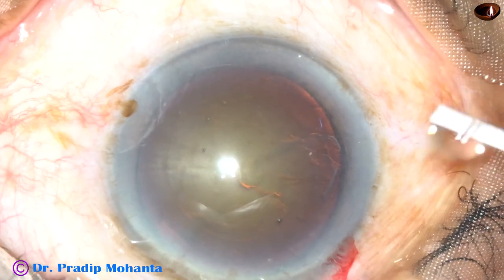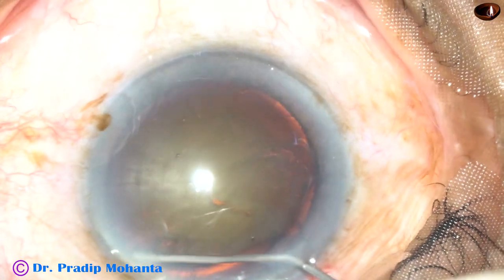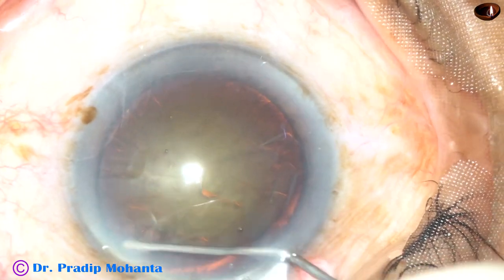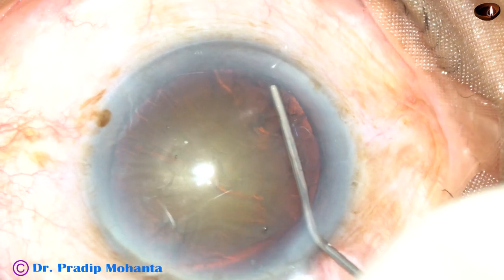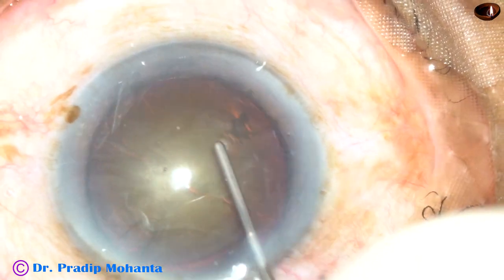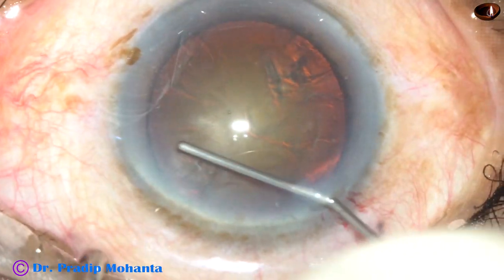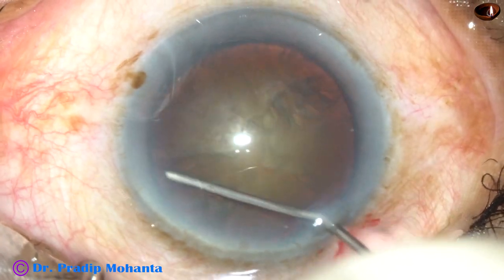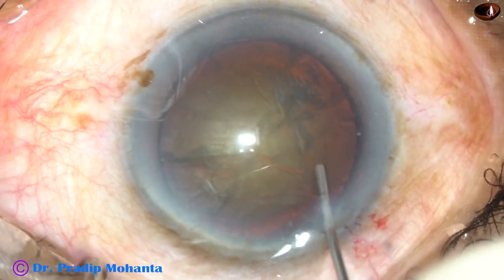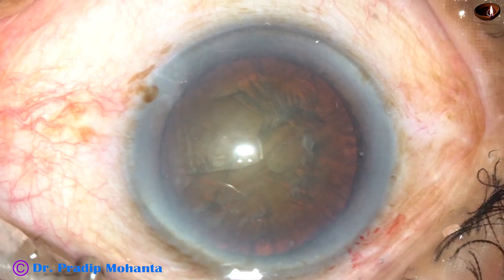Hydrodissection is being done with a 27-gauge cannula. The nucleus is then tapped. Some more hydro. And the nucleus rotates very nicely.